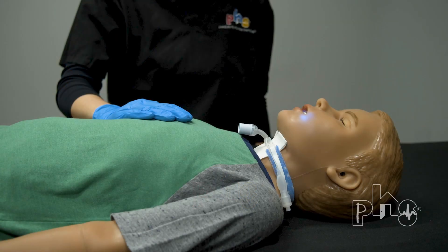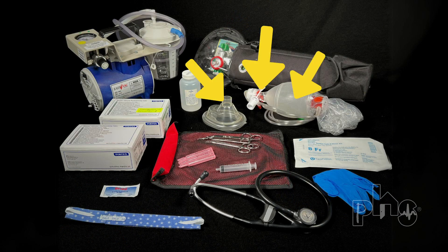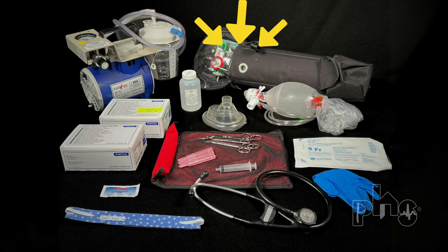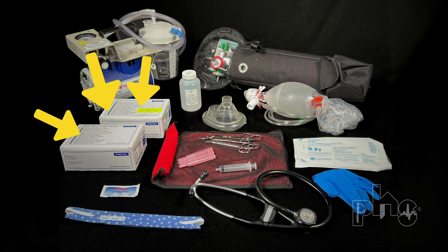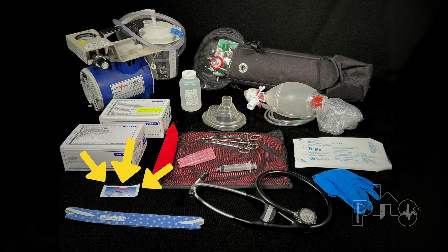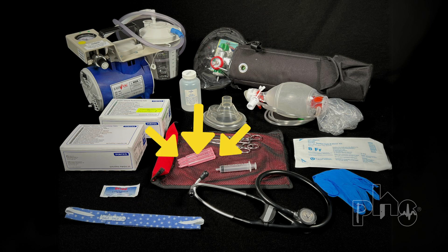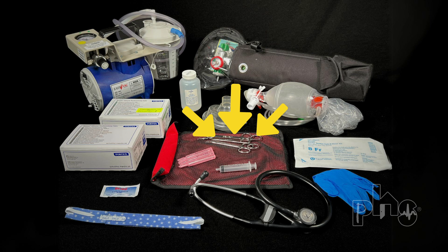When caring for a patient with a trach tube, the caregiver must always have emergency supplies at hand. These are a resuscitation bag and mask, an oxygen tank, an extra trach tube and downsized trach tube, a suction machine and suction catheters, trach change supplies such as gloves, lubricating jelly, syringe, trach ties, saline tubes, scissors, Kelly clamp, a wire cutter if needed, sterile water, and a stethoscope.